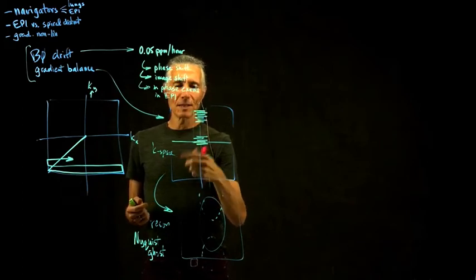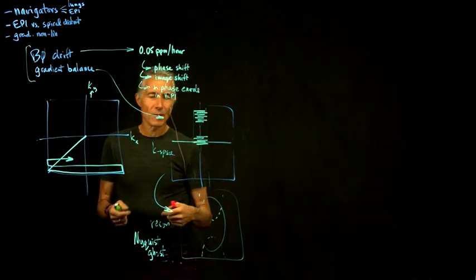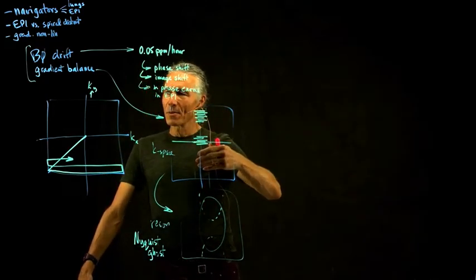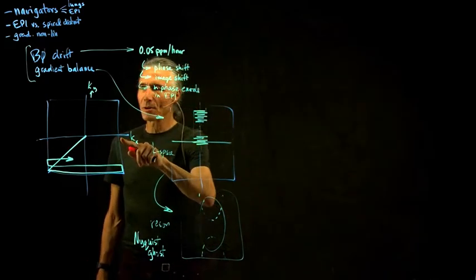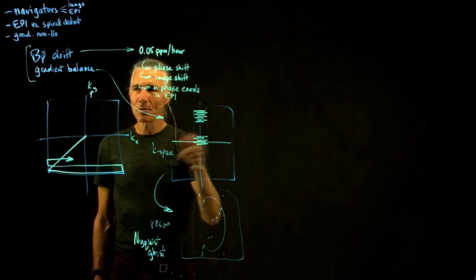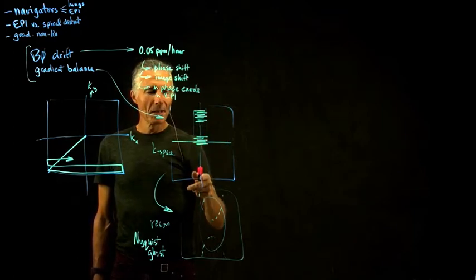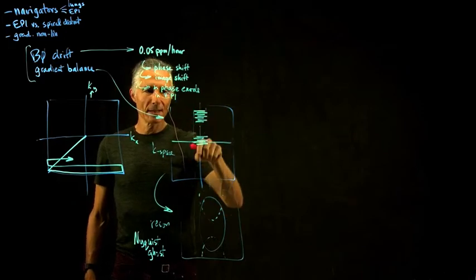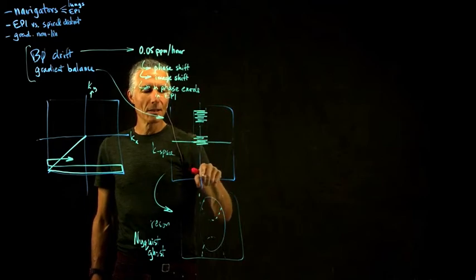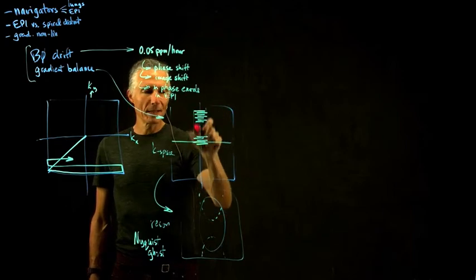You would put the person in the magnet and then collect a scan with the blips turned off. If you turn off the blips and just go back and forth repeatedly, you'll get a whole bunch of bright echoes, because you're going through the center of k-space repeatedly. They get a little lighter as you go down because of T2 decay, but you'll basically have a strip like that.